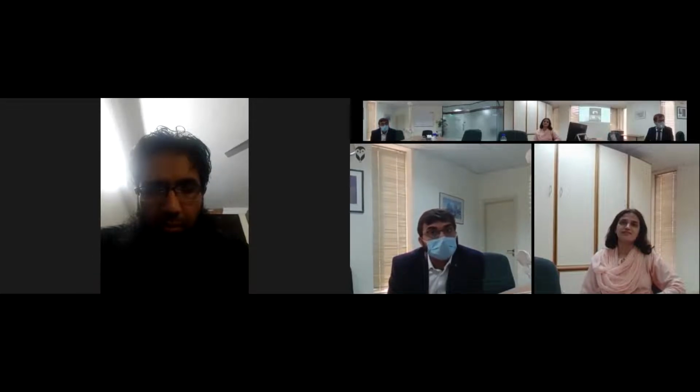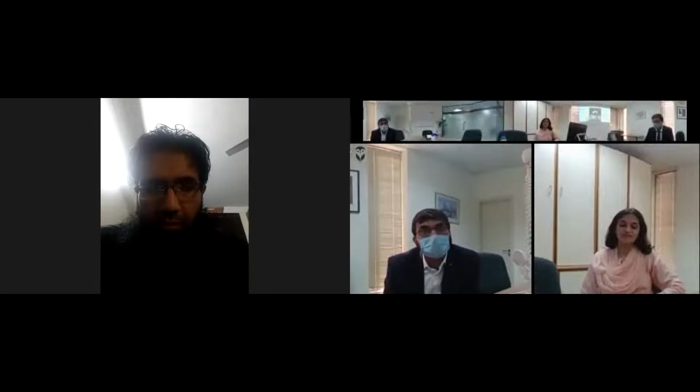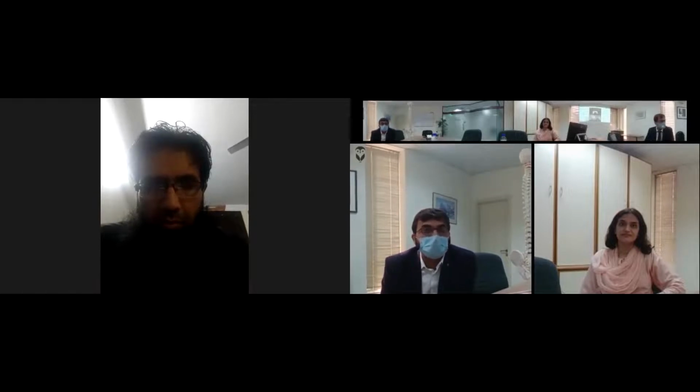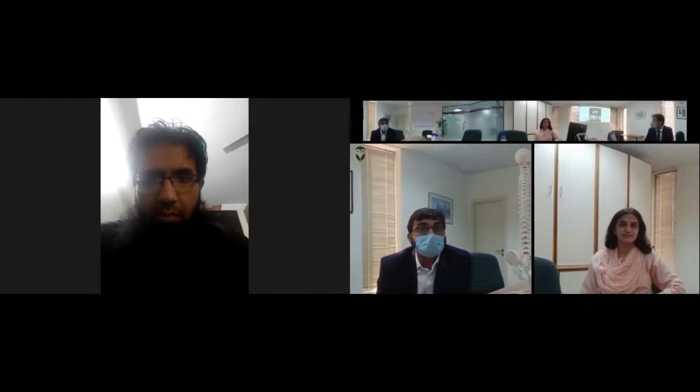You really see where you are actually going, as compared to what's on the fluoroscopy. But there is a real downside. Once you're used to doing it under fluoroscopy, you have a lot of space for yourself around the patient, and room available for doing anything, as compared to the CT. CT is kind of a tunnel, the patient is moving in and out, you're going in, passing the needle millimeter by millimeter and coming out. Or maybe you have a suite where you can see the screen and the radiographer is helping you. At the same time, there is the radiation dose you're getting with the CT as compared to the fluoroscopy, and then comes the cost and the availability overall in your institution.